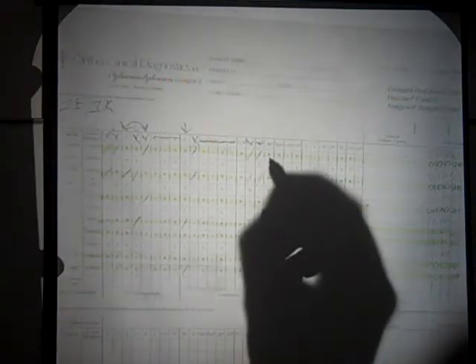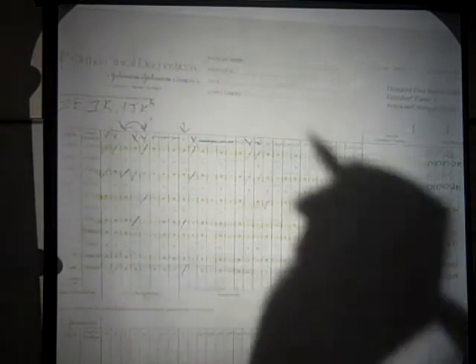JKB, I can use cell line 5, just cell line number 5, so I need one more JKB. The XG system is like the D system, it stands alone, so I just need 2 XG. There's one, and there's one, and I have ruled out XG.